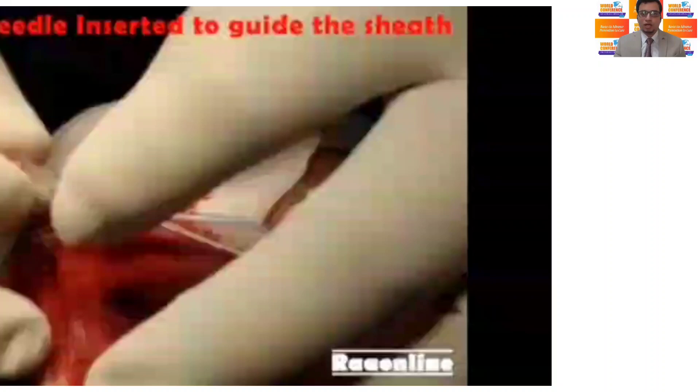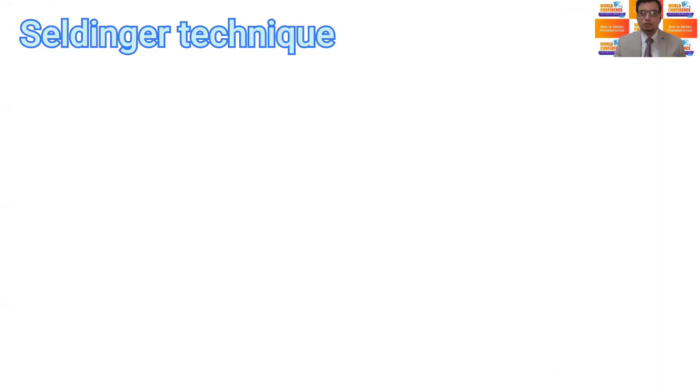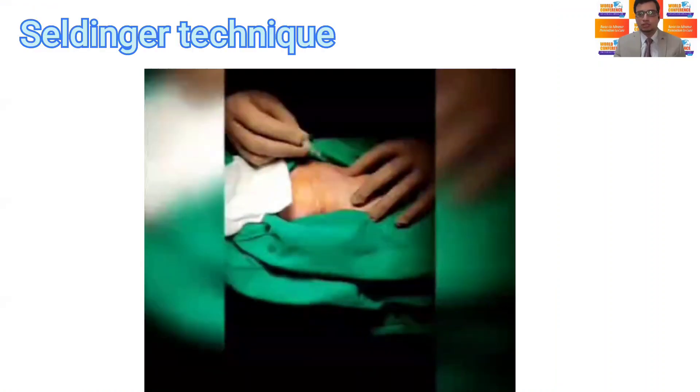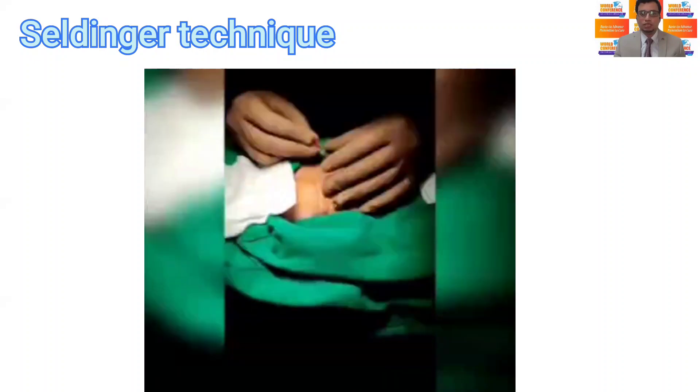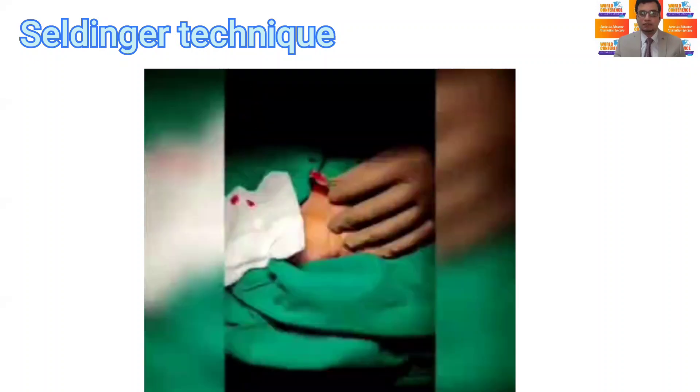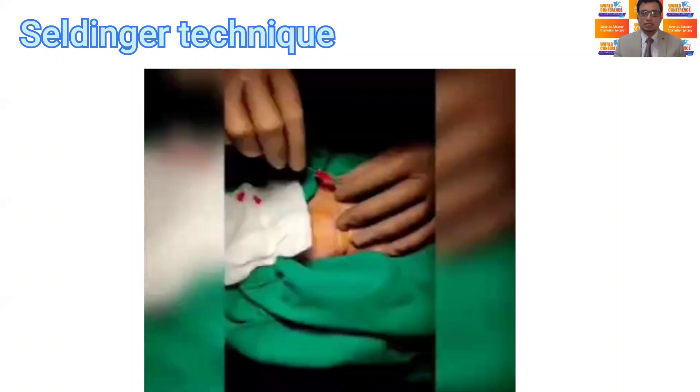In over-the-wire or Seldinger technique, initially insert the introducer needle without catheter into the artery. Once pulsatile blood flow is obtained, advance the guidewire through the needle and finally thread the arterial catheter over the guidewire.